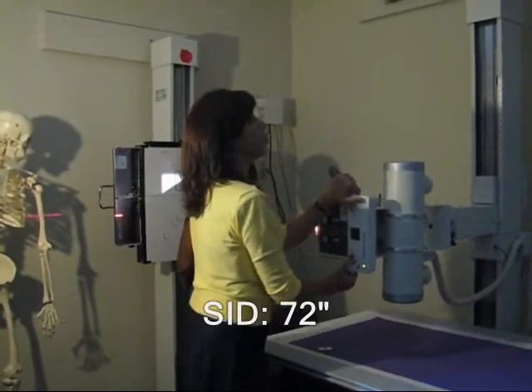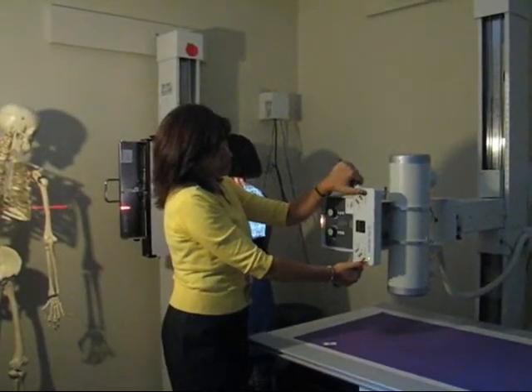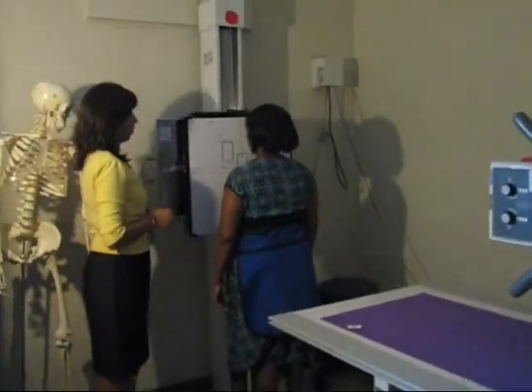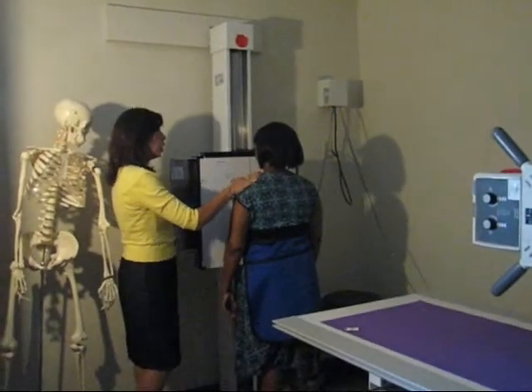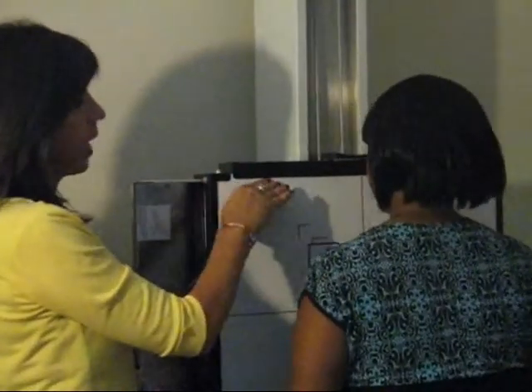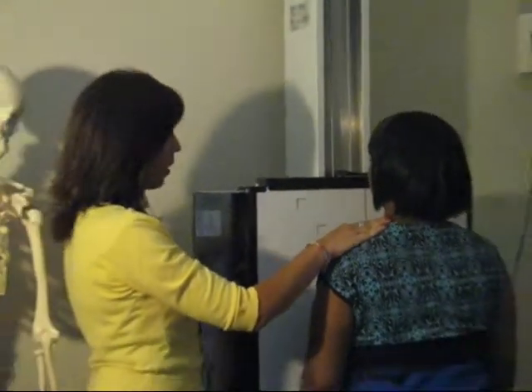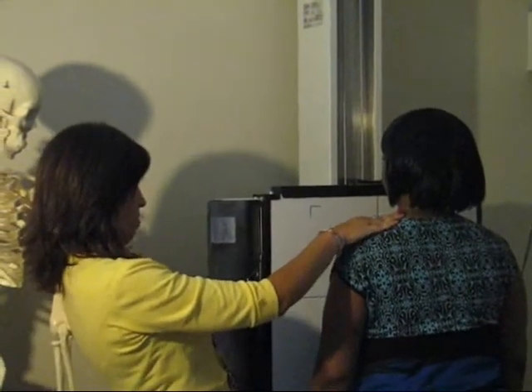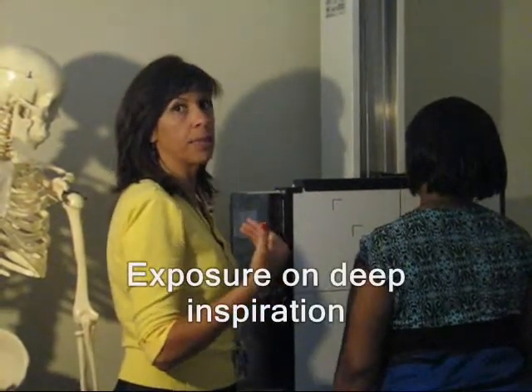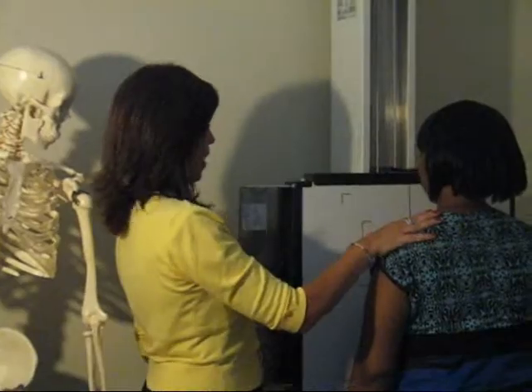Your SID for a PA of the chest is 72 inches. You want to place the IR about 1.5 to 2 inches above the shoulders. The reason for that is because you're going to take this x-ray with the patient in deep inspiration, which means that the shoulders are going to be a little higher than at rest.